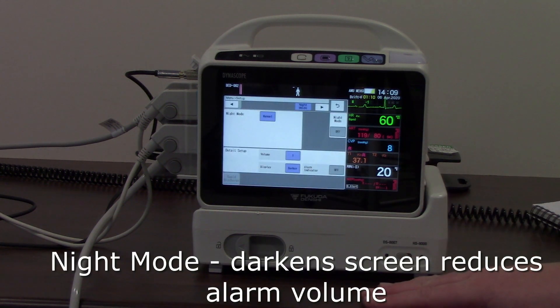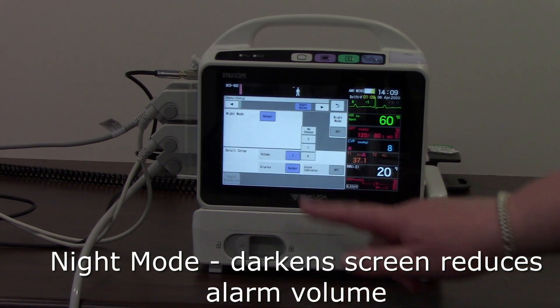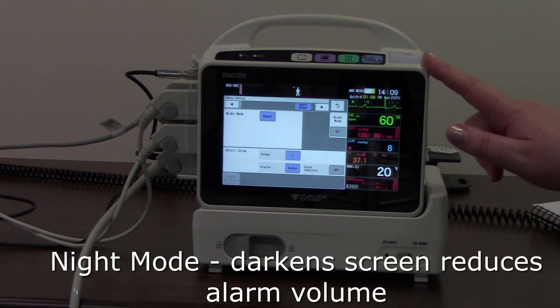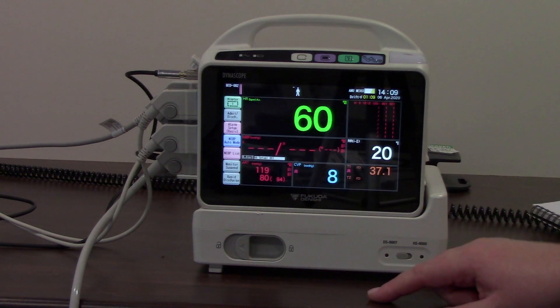This section allows me to set my night mode. I can choose how loud I want my volume to be, how dark I want my screen to be, and whether I want it to flash or not when it alarms. I can then turn night mode on from here.